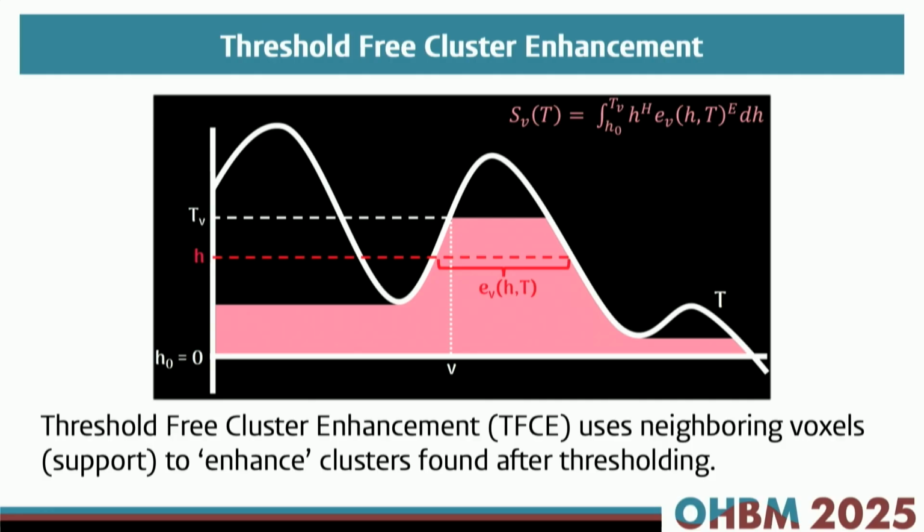That means that all the statistic values are taken into account when calculating the TFCE statistic. It's easy in this way, and this is why it's threshold free in a sense: if you set H0, you do that for every voxel. You don't have to define a threshold beforehand, you just take 0 as a threshold. Well, this is where we have interesting discussions with people. You can say that it's threshold free in a sense because we take 0 as a starting value, but 0 in essence is also a threshold, of course. It's only a very low threshold.